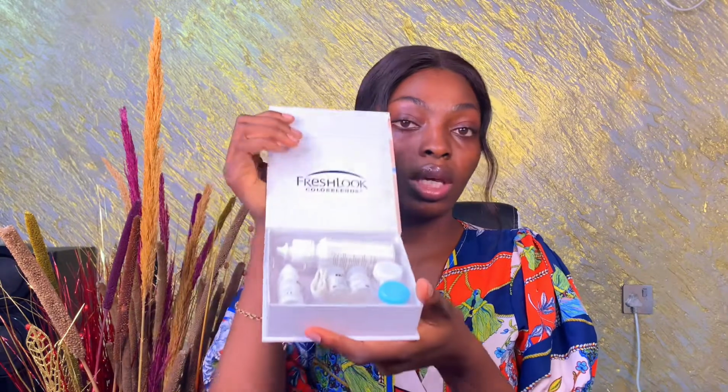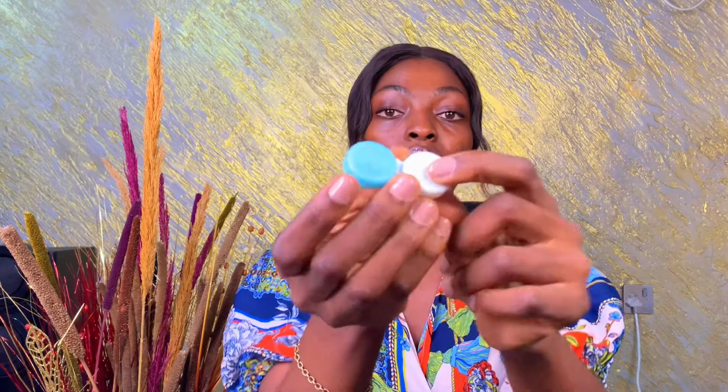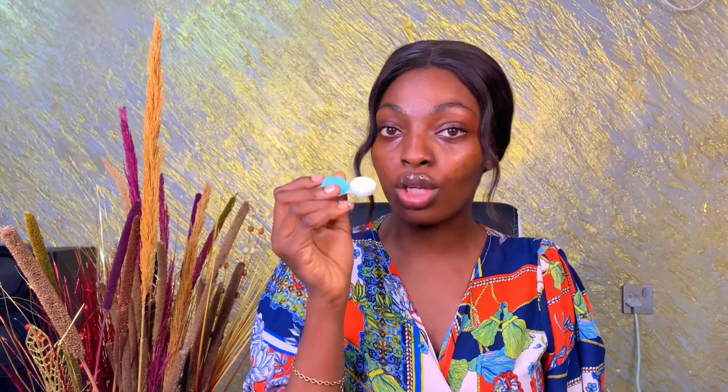So when you open your kit, this is what it looks like. I'll first bring out the case where I have my lens in already with solutions in it, labeled right and left, so you don't mix up the lens you use on your right eye for the left. Now, if you want to wear your contact lens after you've used it before, first thing, change your solution. I cannot overemphasize that. You have to change your solution.